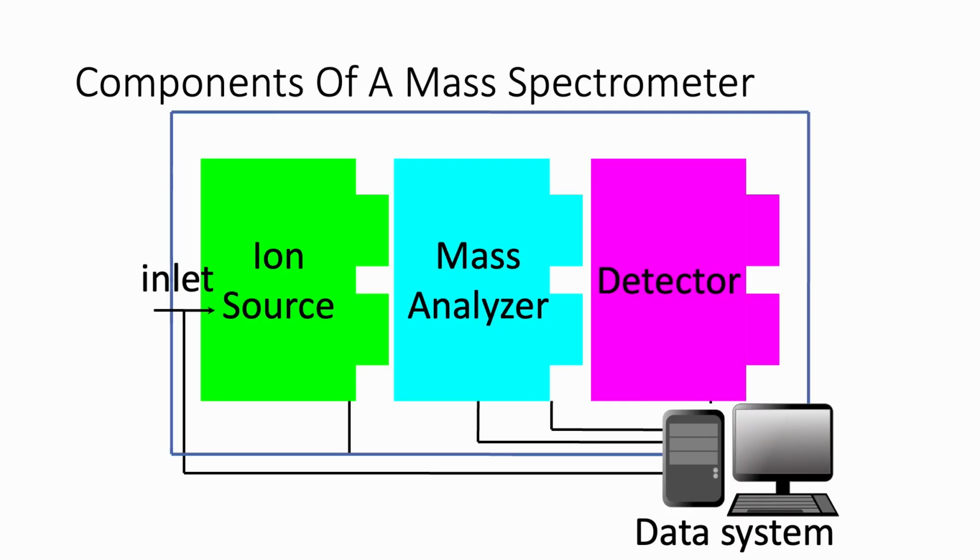But just as a reminder, you have something called an inlet, which is basically a very tiny tube that is delivering some of that liquid, not all of it, but some of that liquid continuously through the analytical column. So as your compounds of interest and as that liquid flows through the analytical column, some of that gets diverted through your inlet into the mass spectrometer to be assessed or analyzed.